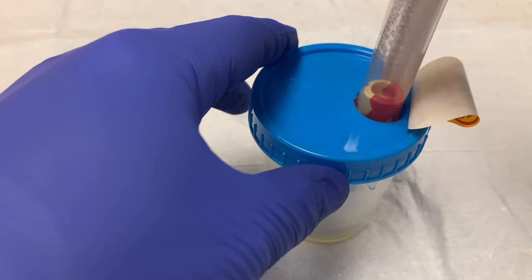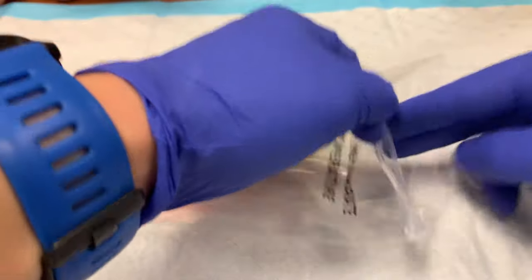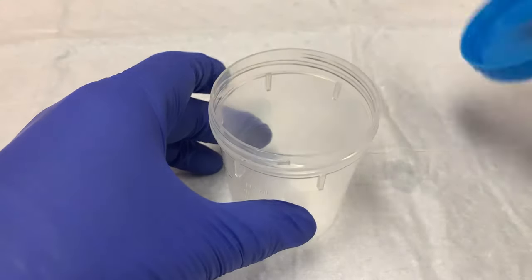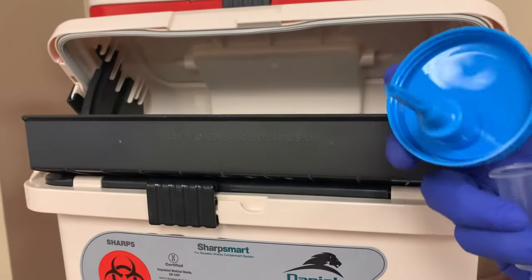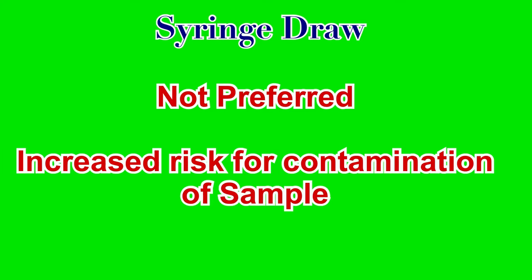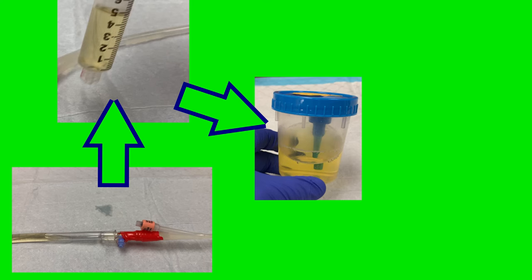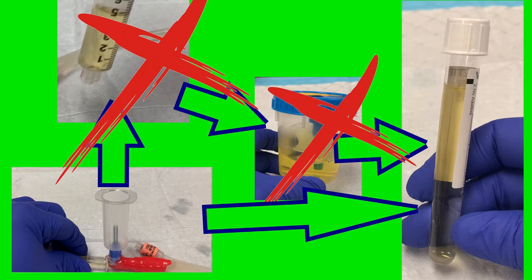Collect the tubes in order: gray, marble, white. Label the samples, task it off in EPIC, and send them to lab in a biohazard bag. Remove the lid from the sample container, dispose of any additional urine in the toilet, place the blue lid in the sharps container because it contains a needle, and dispose of the cup itself in the trash. This is not the preferred method because of the increased risk of contamination — every time you transfer the sample there is a new risk: first in the syringe, then to the cup, and then to the lab tube, whereas the vacutainer adapter method eliminates two of those containers and their associated risks.